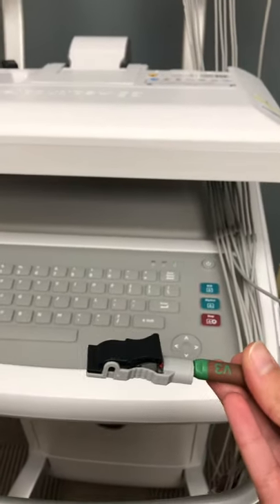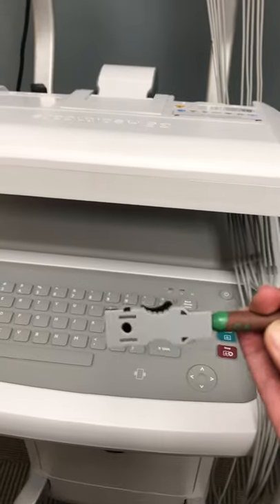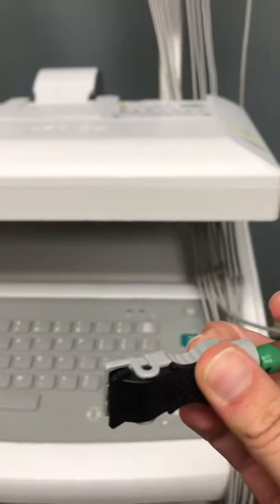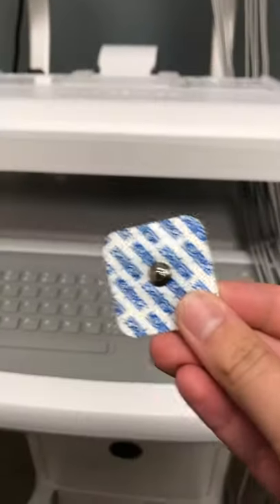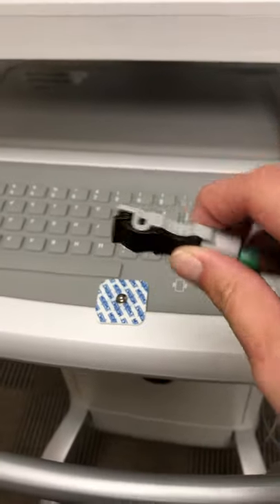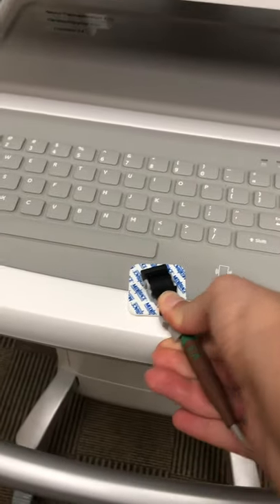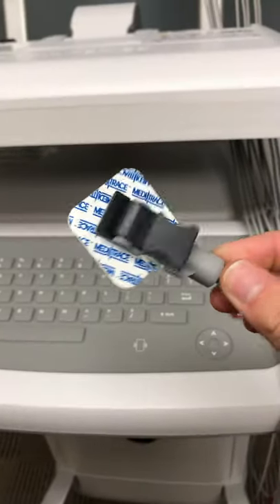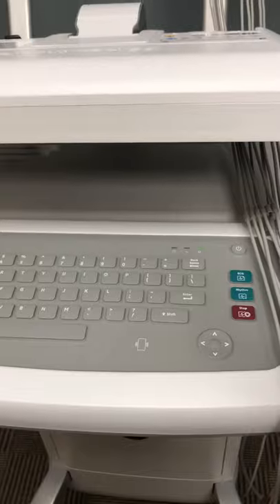If you are using your electrodes and find that they're not sticking appropriately on the back of your leads, you'll see a hole on the lead. All you have to do is push down on the clamp, push the lead onto it, and then you can use your 5-lead electrodes if the 12-lead ones aren't working.